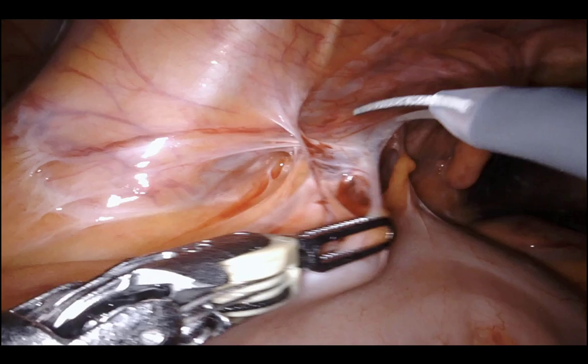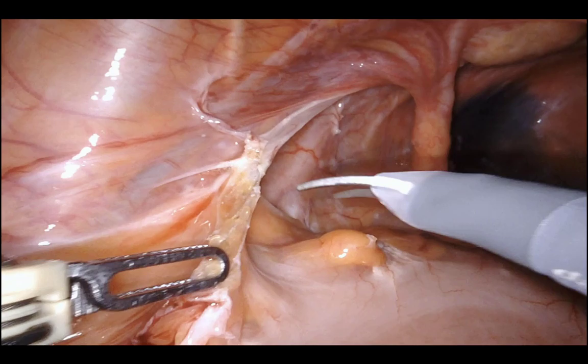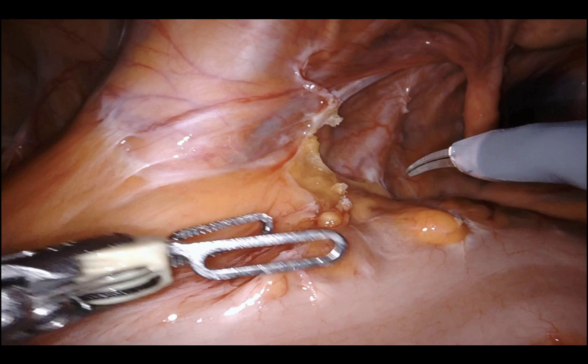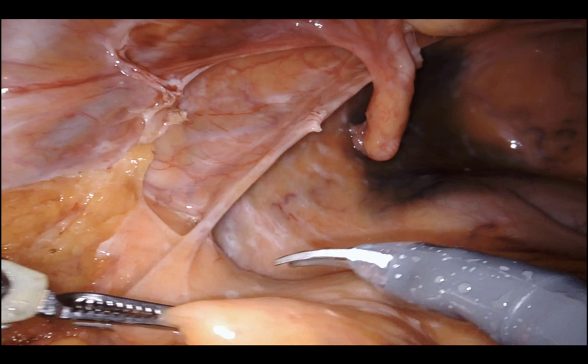Step zero of the operation is to restore normal anatomy. That includes dividing any lateral attachments. You want to make sure lateral attachments are taken down so you can set yourself up for the medial-lateral dissection as you elevate the recto-sigmoid junction anteriorly. Essentially you're tenting the IMA pedicle at a 90-degree angle to the aorta, and the only way to do that is if the lateral attachments are taken.